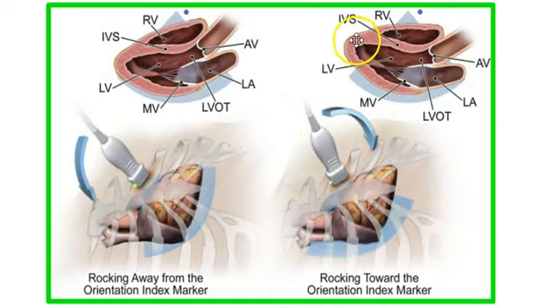You see the image has picked up on the tip. It's just a little bit higher here than it was in the RVs. This is more like square on, where this one here is kind of angled down just a little bit. You see the difference between these probes, where one is angled more this way and one is angled more that way. So you tilt this way to get the image to move on the screen. Here's our orientation marker up here. So what we're aiming at, what our index marker is pointing to, will show up on the right side of the screen, which in this case, when you slice and dice this out, is going to be the aorta in the parasternal view here.